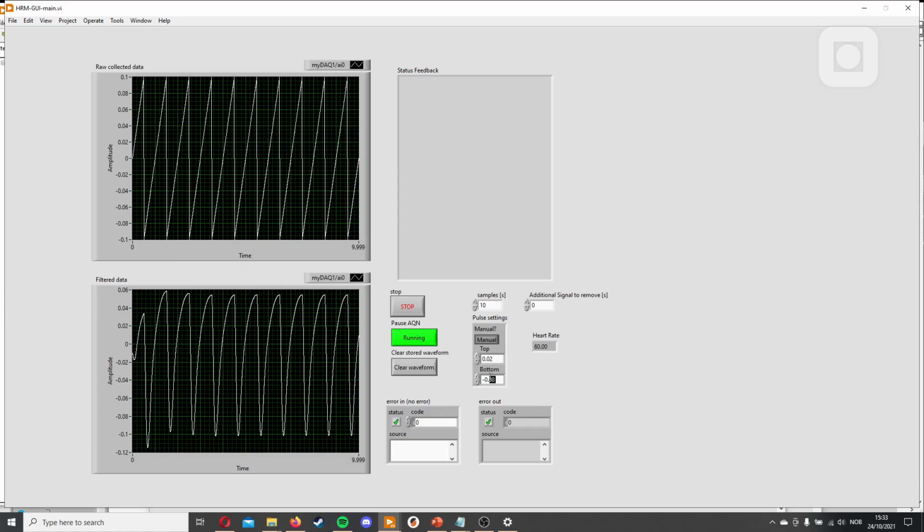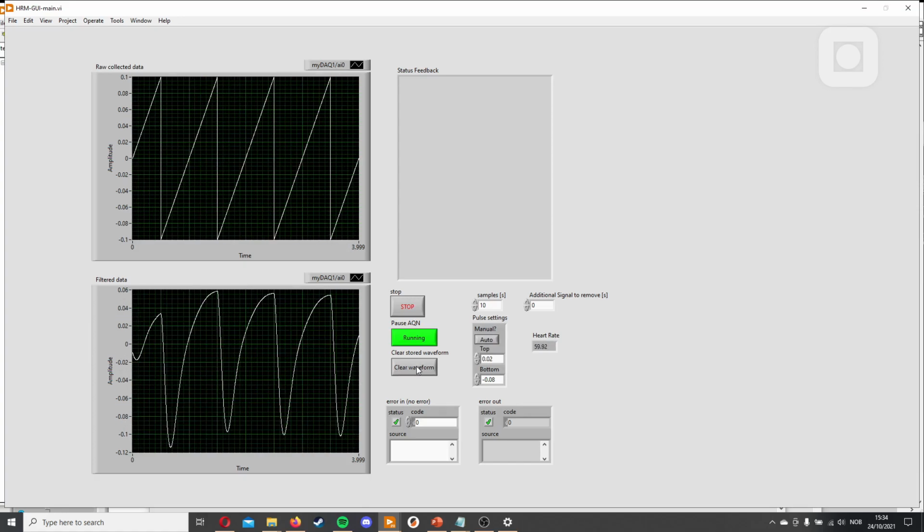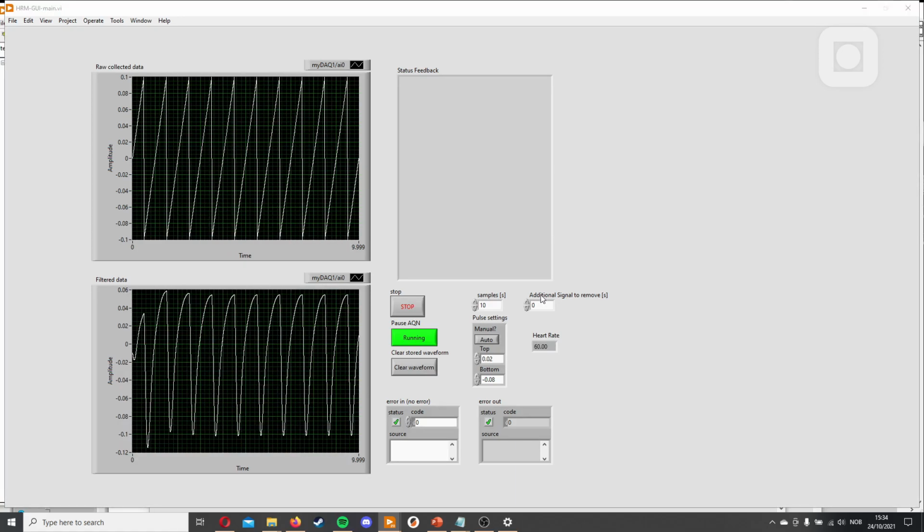But to show that it doesn't really work, if we say 0.04 where we drop 1, we will get a completely different result. 54, because it drops 1 peak, so it's 1 beat less. And that shows that our function works. And it has even more accuracy than the old one from the beginning, but also we have a bit more control. So in this lesson, we saw how to make a manual peak detector.